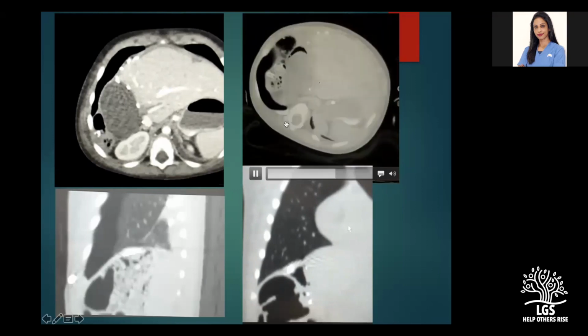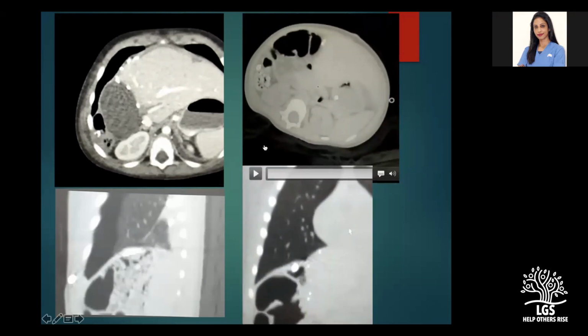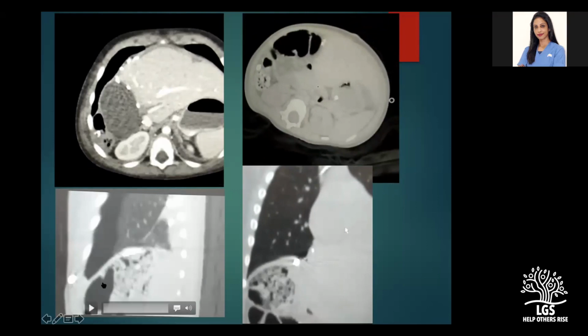And so that is that. Once you create a pneumothorax, getting inside this collection can be fairly easy. So after we created the pneumothorax, we got inside the collection, the drain tube is just there. And once you insert the drain tube, we can actually suck out the air, because it's an artificial pneumothorax and you have just punctured the parietal pleura. Artificial pneumothorax is created when you only puncture the parietal pleura. When you puncture the visceral pleura, obviously it's a different thing. But here the visceral pleura is intact. So literally the lung will expand immediately as soon as you suck out the air.